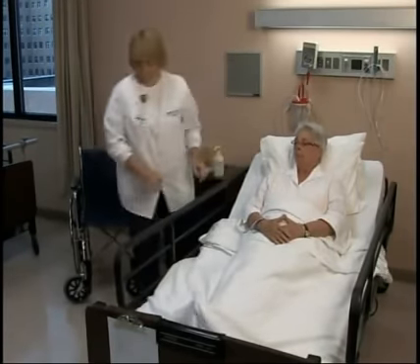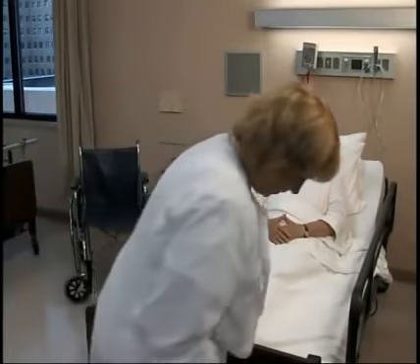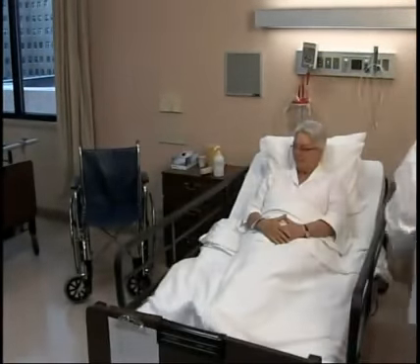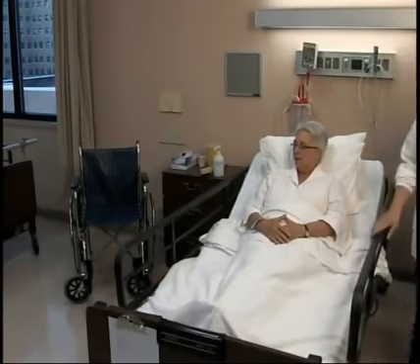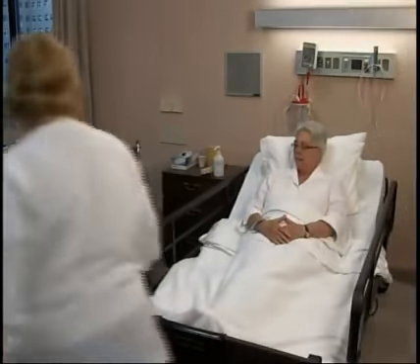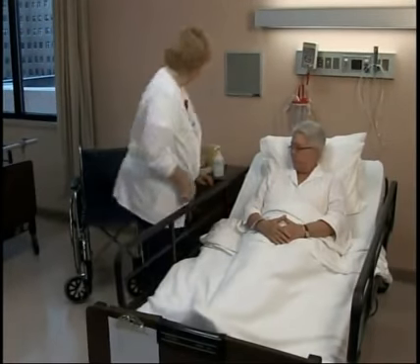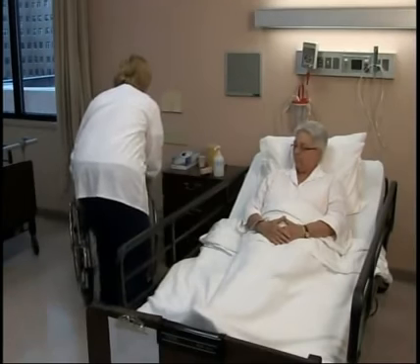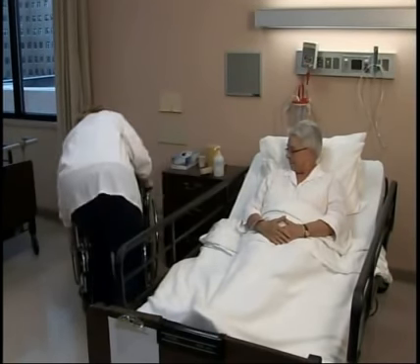Check that the wheels on your bed are all in the locked position. You will need to check all wheels for this. Pull the chair or the wheelchair next to the bed. Take off or swing away the footrests.